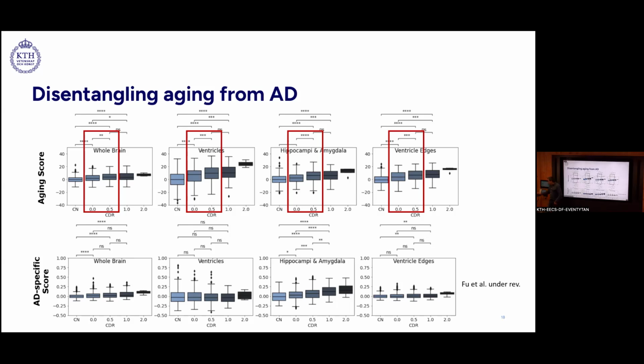We checked this in different regions of the brain, and what we found is that we can find differences just with brain age in all these regions in early stages of Alzheimer's. But if we go for the red arrow, we didn't find anything here or here, but it was actually visible here: the hippocampus and amygdala, which are well known for being affected by Alzheimer's.